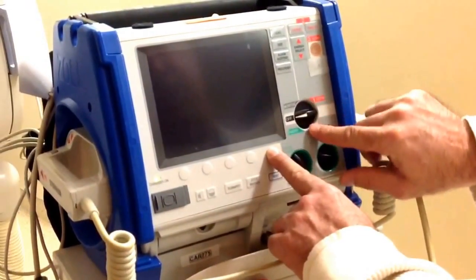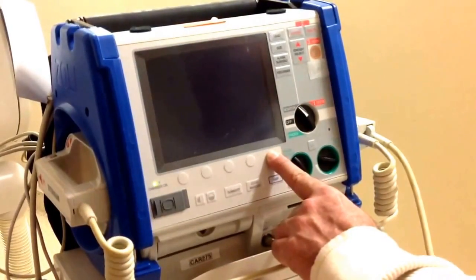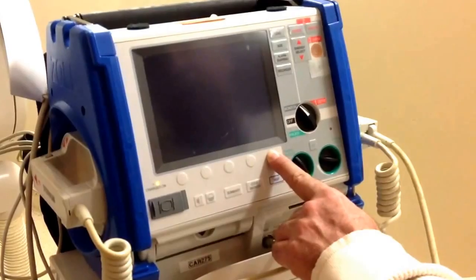Turn the selector switch to the monitor position and the set time screen should appear on the monitor.